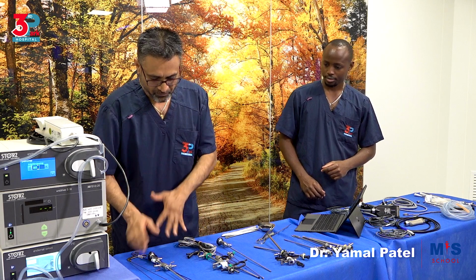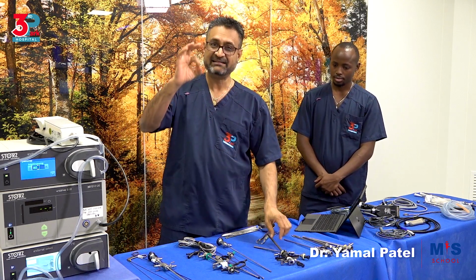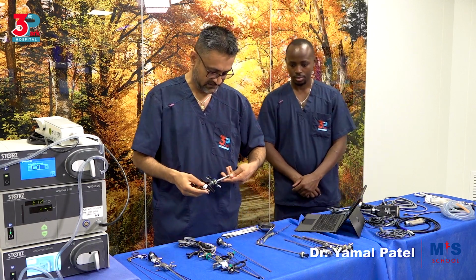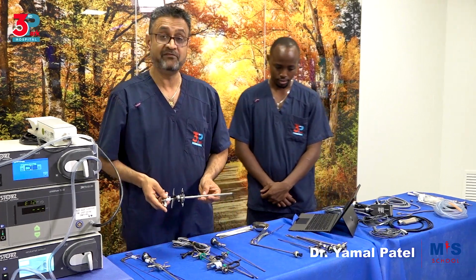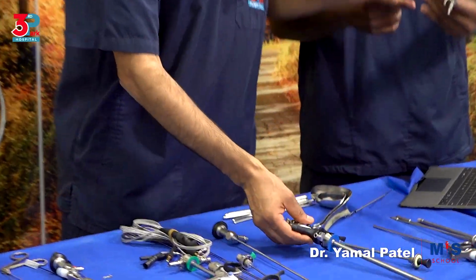And then we have a 2.9 mm scope. Most resectoscopes are a bit wider in diameter. This resectoscope, if you can see here, is written 8.5 millimeters, so it is a 26 French.